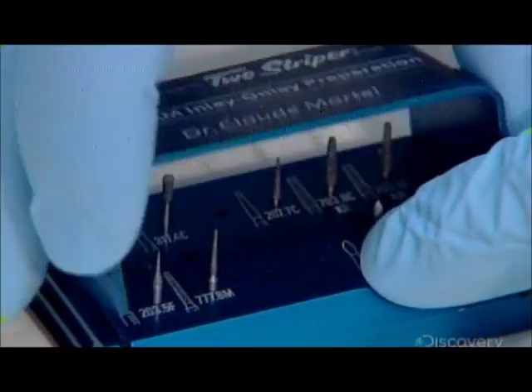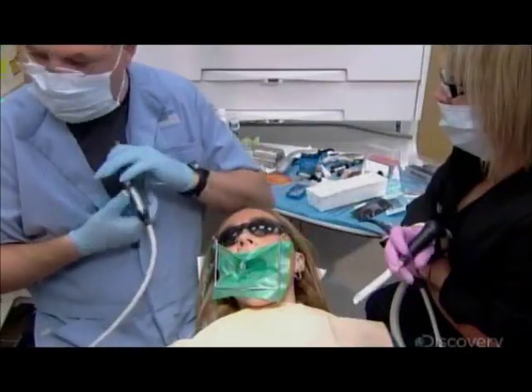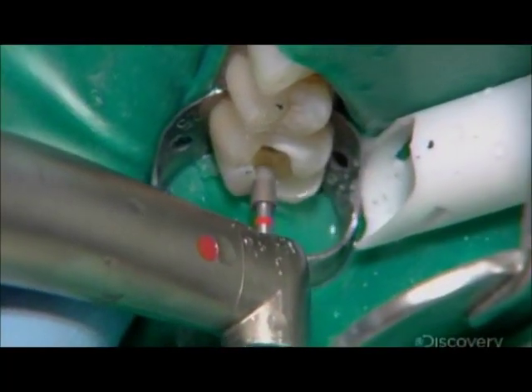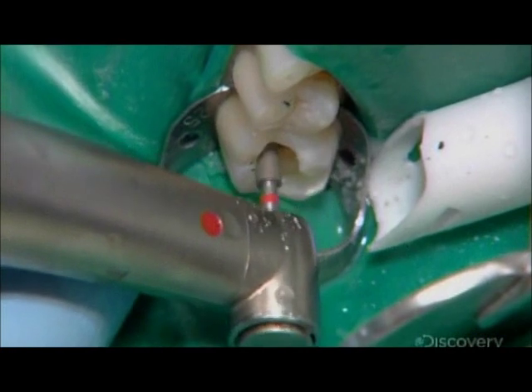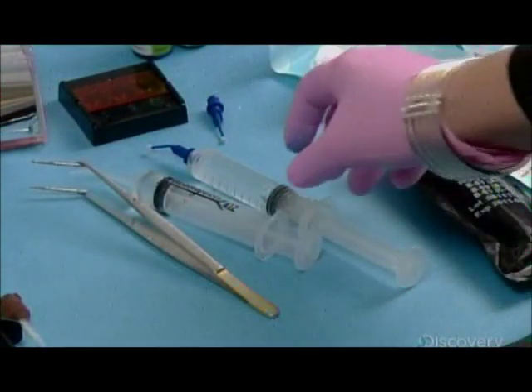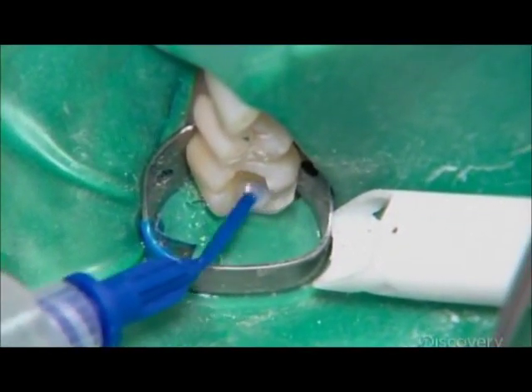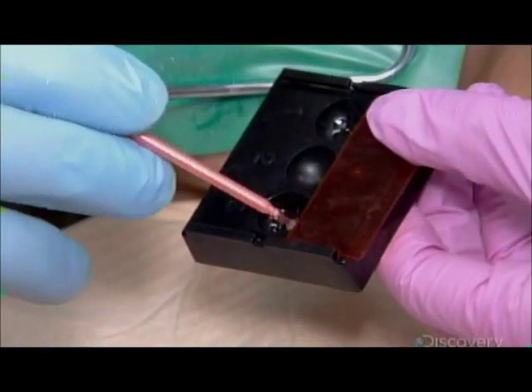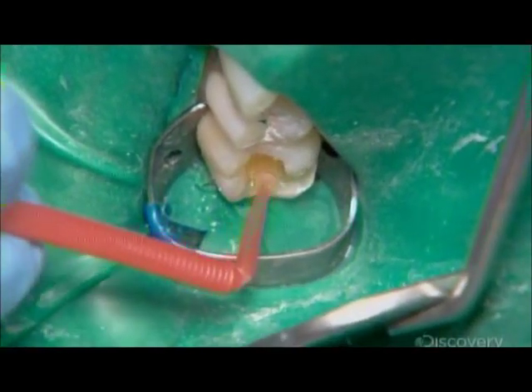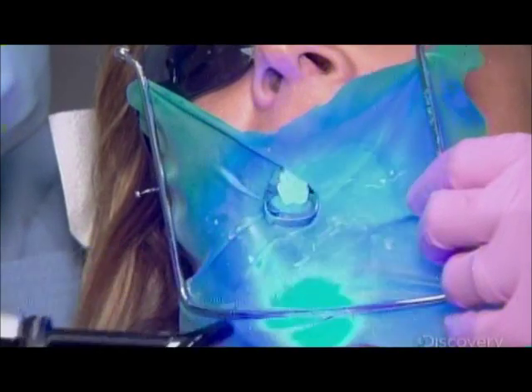He switches to a smaller bit to excavate the remaining filling particles and to remove decay. Each cavity must be completely clear before the restorative work can begin. The dental assistant then scrubs an antimicrobial solution into the tooth, and then brushes an acidic conditioner into the cavity.